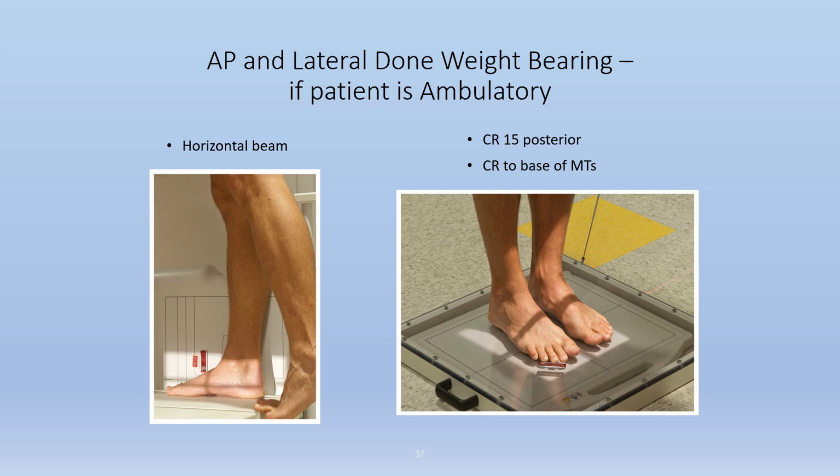You'd still be at a 40-inch SID, and ideally, they typically will order these bilateral, but if it was just a unilateral foot, your technique would be no different. It'd be 65 at 1.2. You would have the IR run parallel with the long axis of the foot if it was one foot, a unilateral foot. If they did both feet at the same time for bilateral, then you would likely turn the IR landscape and do both feet.